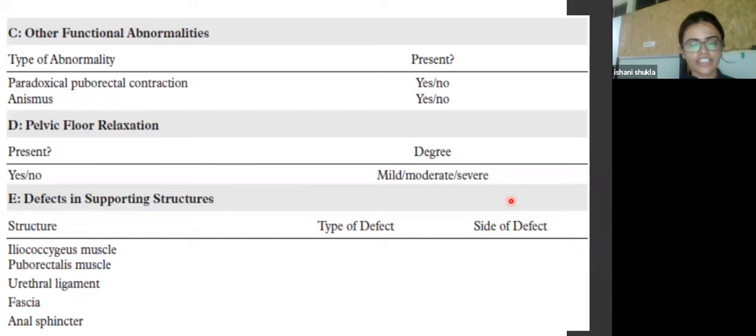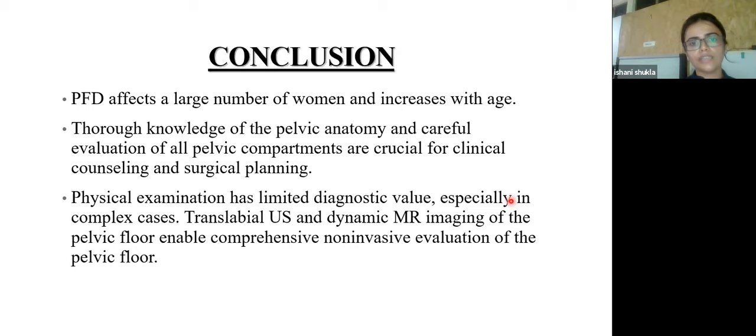So to conclude, pelvic floor disorders affect a large number of women and increase with age. Thorough knowledge of the pelvic anatomy and careful evaluation of all pelvic compartments are crucial for clinical counseling and surgical planning. Physical examination has limited diagnostic value, especially in complex cases, and transperineal ultrasound and dynamic MR imaging of the pelvic floor enable comprehensive non-invasive evaluation of the pelvic floor. These are my references. Thank you.